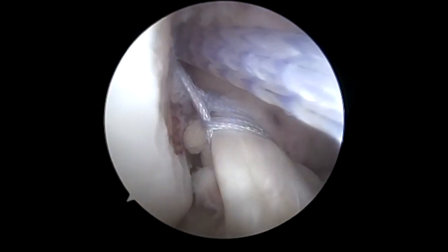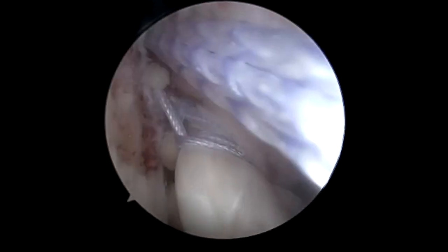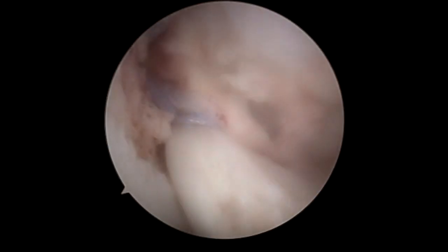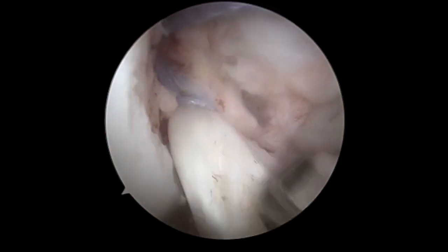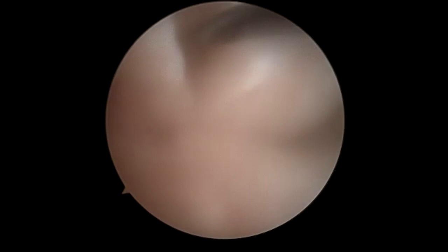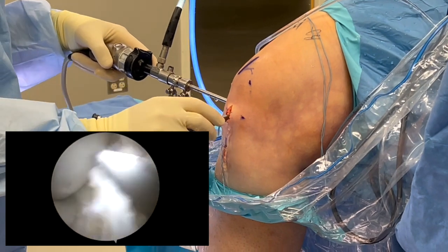Before we finish the internal brace, we're going to tension the ACL back to the wall as much as possible. The key here — this is different from the regular ACL repair — is you do not want to put the internal brace in first because you're going to need to pass the BEAR implant. We've taken out all the slack, holding the internal brace to make sure the button doesn't pull into the IT band. The Lachman shows it's completely returned, and now we're going to pull the internal brace out of the lateral portal.